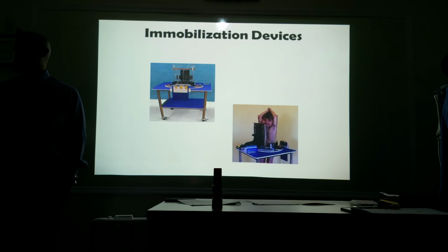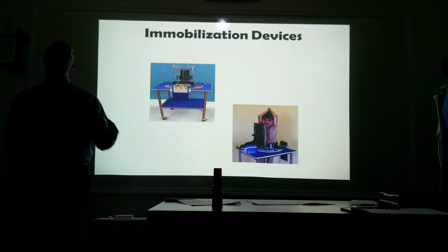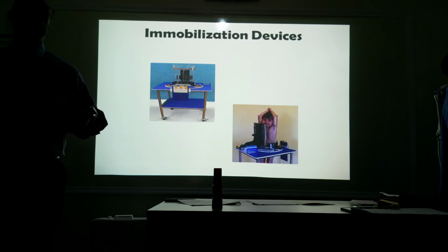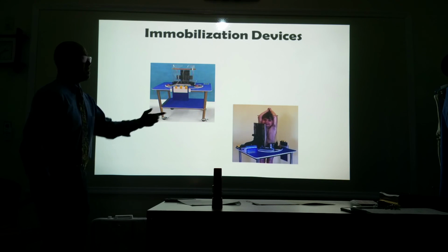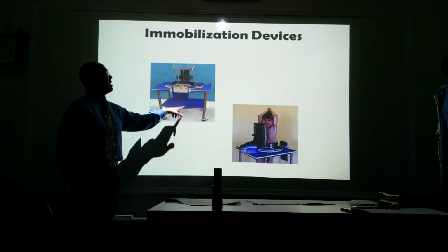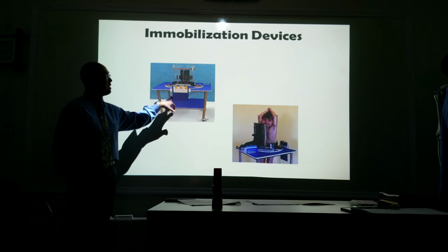Here's an immobilization device. It's known as a pigostat. And here's the concept. If you get motion on your image, you'd have to go back and shoot it again, right? What does that mean for patient exposure? Increased exposure. You're doubling your patient exposure by repeating an exam. Especially with kids, we want to minimize it as best as possible. We put them in immobilization devices such as this. It's known as a pigostat. Don't ask me how we got the name, but it's a pigostat.